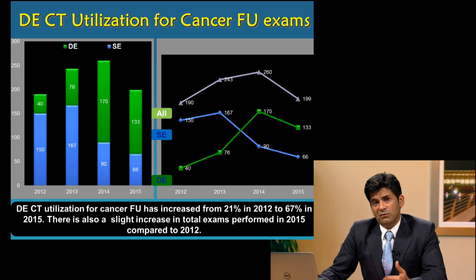Now, the data I'm showing you on this slide is mainly for the cancer follow-up indication. As you can see from the color-coded bar diagrams, in 2012 only 21% of our exams were scanned as a dual energy acquisition for cancer follow-up, whereas in 2015, 67% of exams were scanned using a dual energy acquisition.